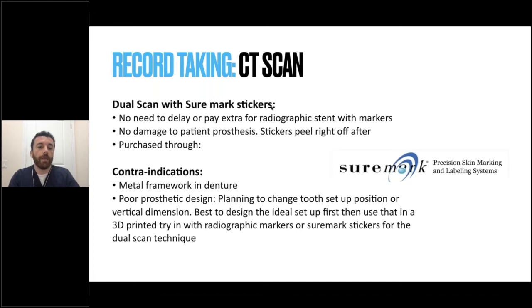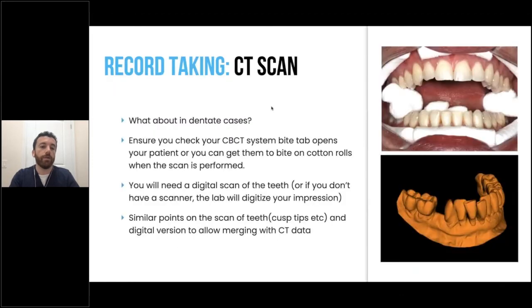So when can you not use this? Like I mentioned, if you have metal frameworks in dentures, or if you have really poor fitting dentures, it's better to get a nice temporary denture either made by yourself or the denturist in order to get that perfect setup, because that's going to dictate also the outcome of your surgery.